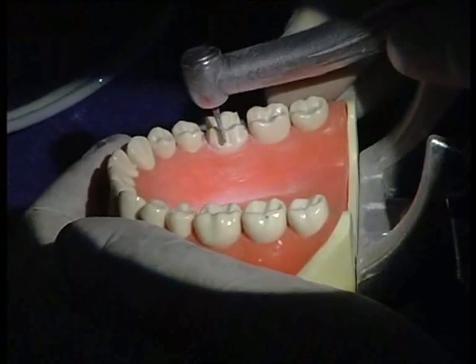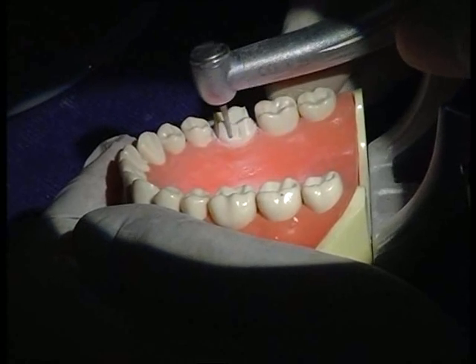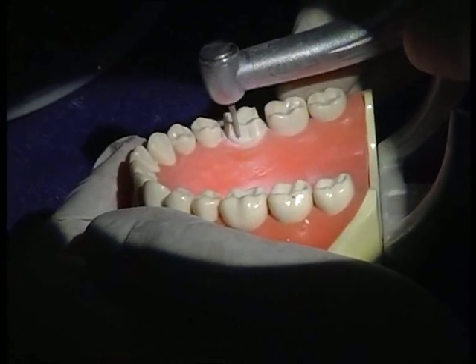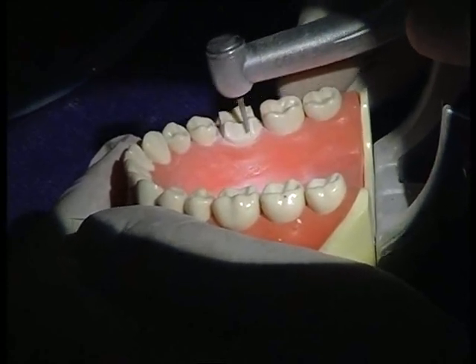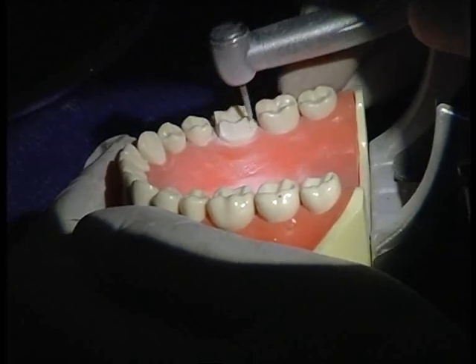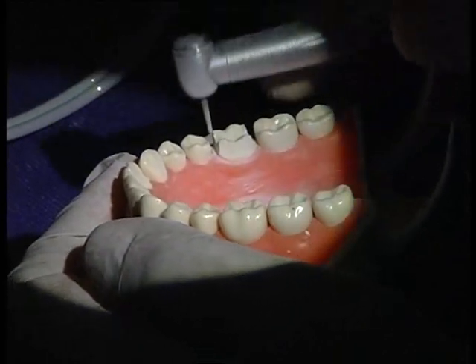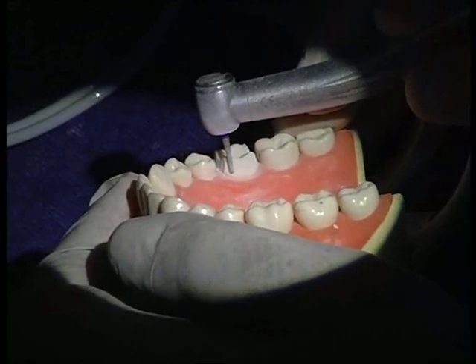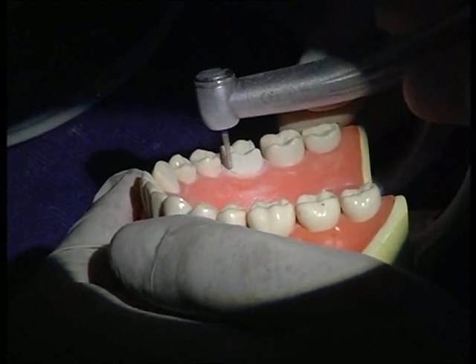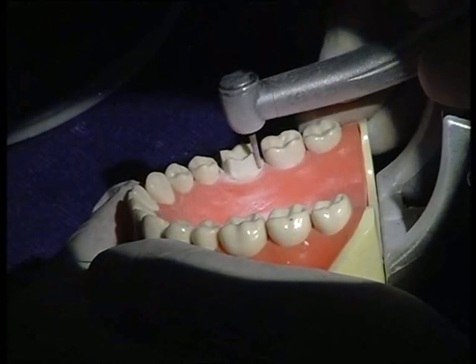All I do is these grooves and then simply connect them. As I move towards the interproximal I will simply go ahead and connect it into the interproximal finish margin that my previous burr has already made for me. Same thing on the other side.